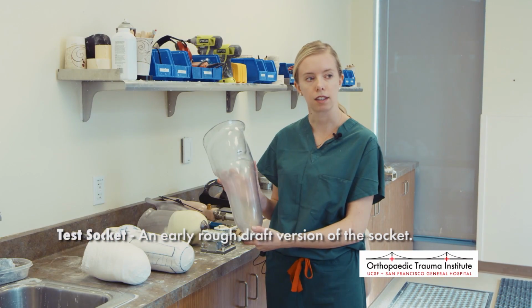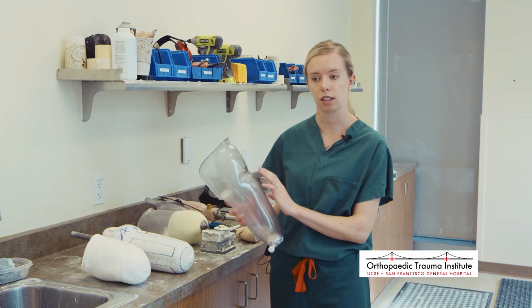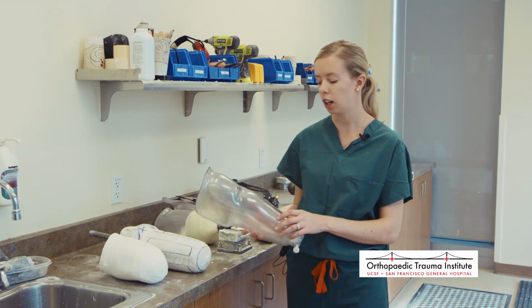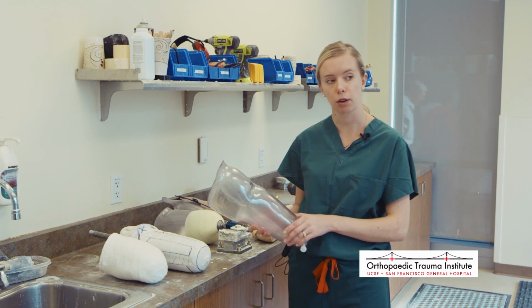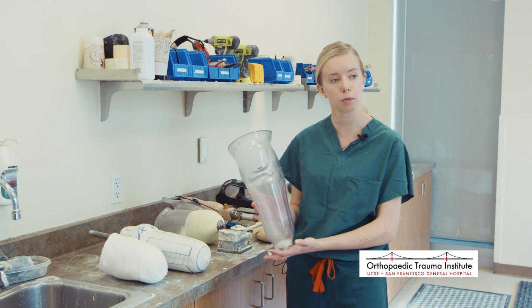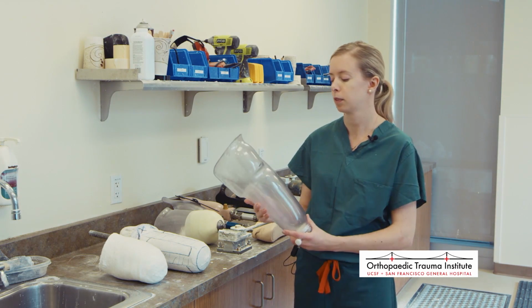And that's what this is, a plastic test socket or rough draft version. The plastic is brittle, so it's not a long-term device, but it allows a lot of changes within a short amount of time. We can heat it and relieve certain painful areas or add pressure where we want more, just so that it's really comfortable. And this is the foundation of the whole prosthesis, the test socket, because if this isn't comfortable on someone's leg or arm, then they're not going to want to wear it. So this we spend the most time with. This is the most important part.